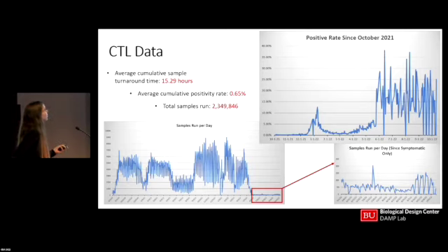So we started averaging around 9,000 a day. And the reason we were able to do this is because we started pooling our samples at the beginning of the process. So rather than putting one sample in, as we had done the whole time, we put 5 into one, push them through the whole process that way, and we're able to deliver about 5 times the results.